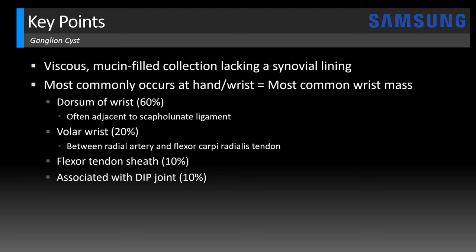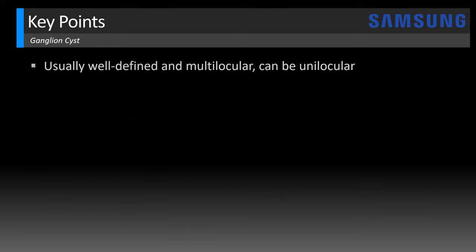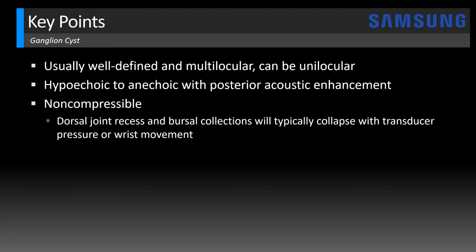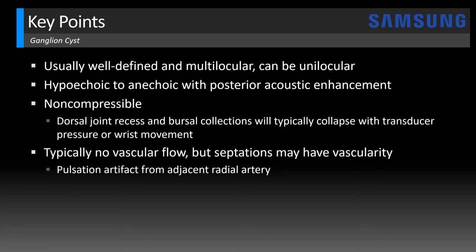They can also be associated with the distal interphalangeal joint. They grow out of the tissues surrounding a joint, kind of like a balloon on a stalk — as in this case, we actually saw a pedicle connecting to the joint. They can fluctuate in size and may increase and decrease over time. They're usually well-defined and multilocular, but can be unilocular, and they're hypoechoic to anechoic, often with posterior acoustic enhancement. A key defining feature is that they're non-compressible, which can help differentiate them from dorsal joint recessed fluid or bursal collections, because those will typically collapse with transducer pressure or wrist movement on dynamic evaluation. We typically don't see vascular flow within ganglion cysts, but sometimes septations may have some minor vascularity. You can also get fooled by pulsation artifacts from the adjacent radial artery, so watch out.